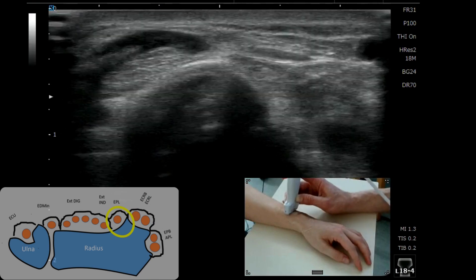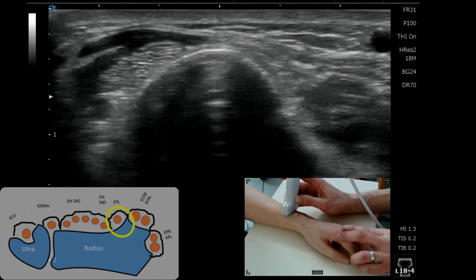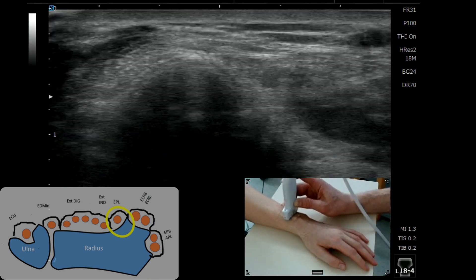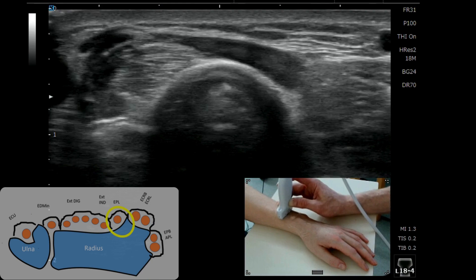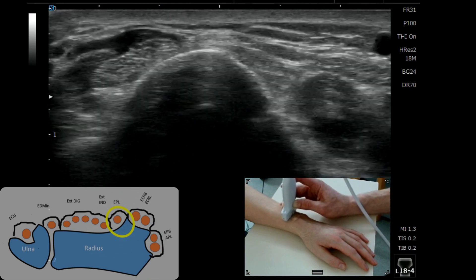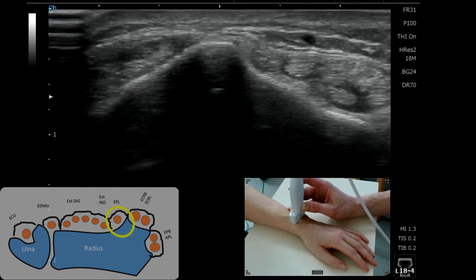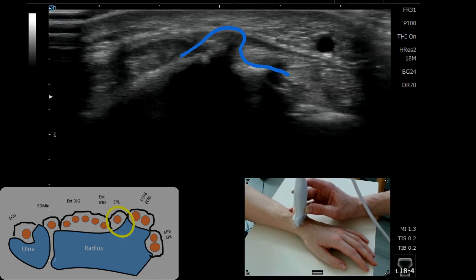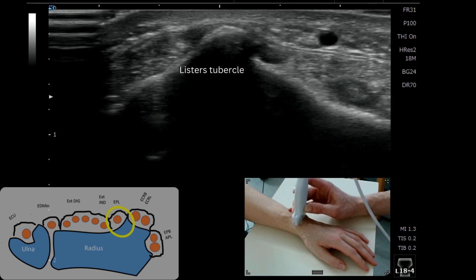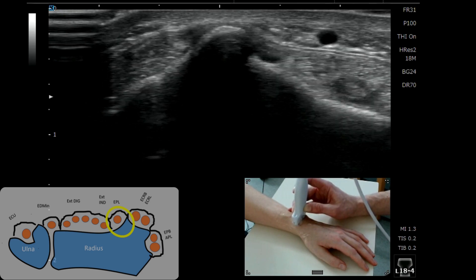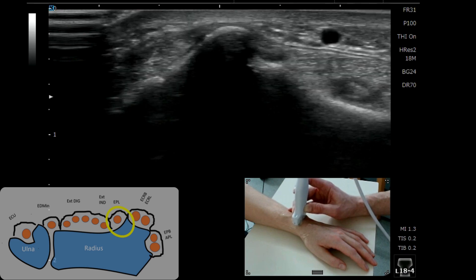If we want to find Lister's tubercle at the dorsal wrist, which is a really important skeletal or bony landmark, we can put a probe on the distal radius, follow down, and we're looking for that distinct bony ridge — and there it is in the middle of the screen. For some patients it's really obvious, for others it's more subtle.